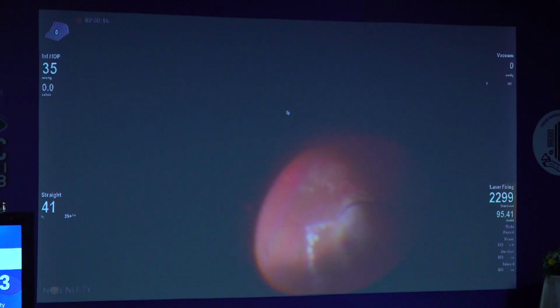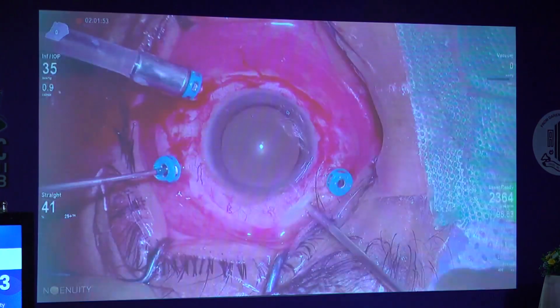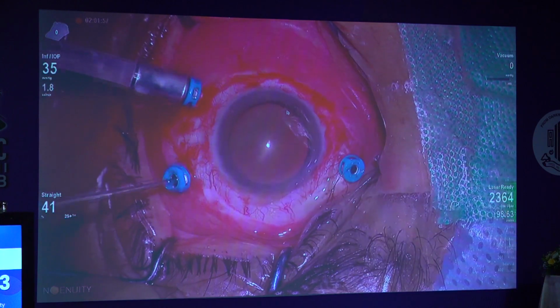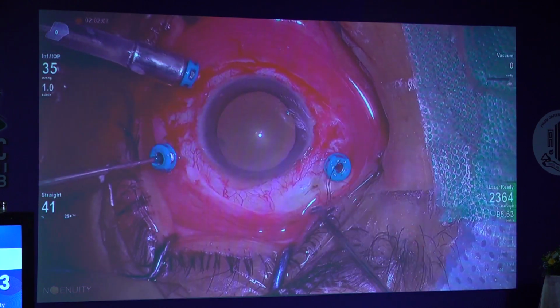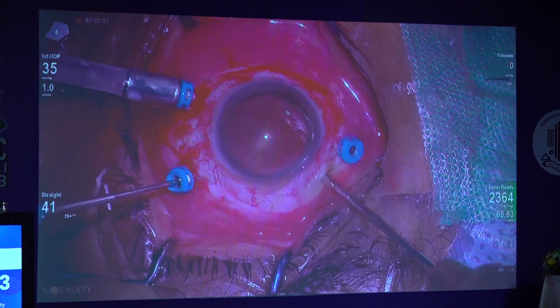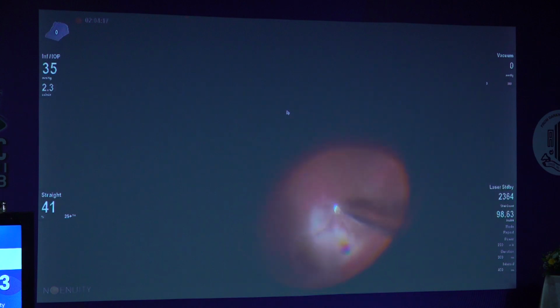A demarcating laser is done. We always take the normal retina also and the diseased retina also. This helps the histopathologist to see it actually. So we need to do a hybrid kind of thing, because the vertical scissor comes in 20G, and we make a fourth port and then go inside, like Dr. Sangeet has done, with 100% diathermy.